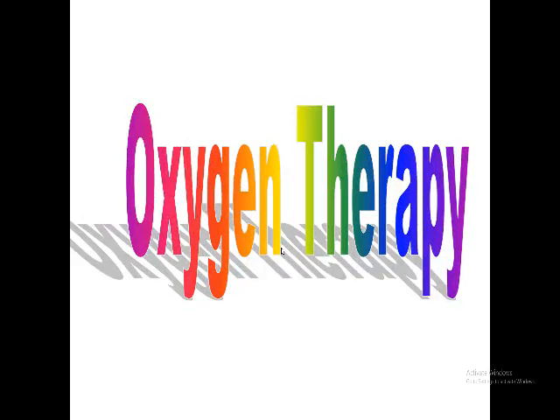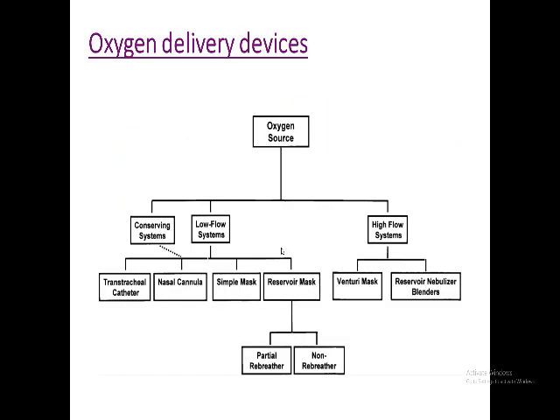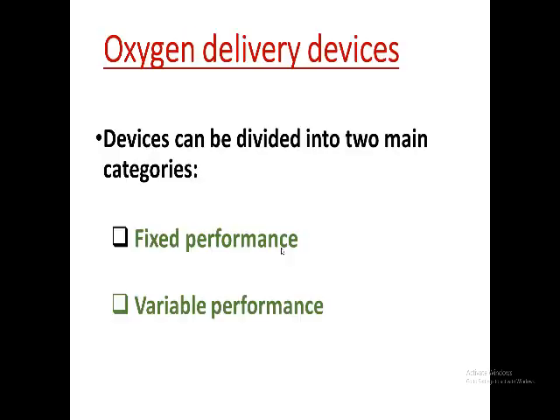I will discuss with you, inshallah, today oxygen therapy. As we know, there are multiple devices to deliver oxygen to the patient. Oxygen is a drug, like any medication you prescribe to the patient. Devices to give oxygen are divided into two main categories: fixed performance and variable performance.